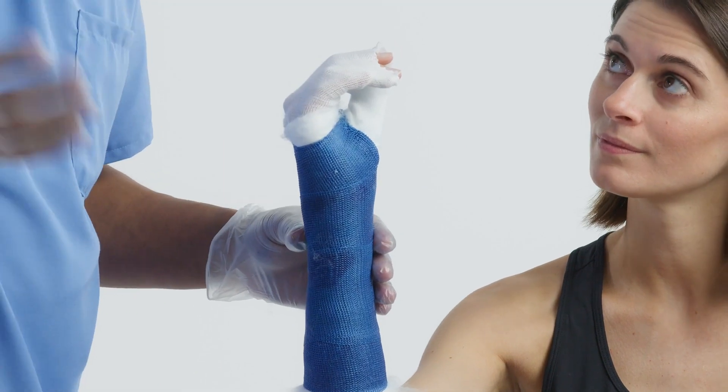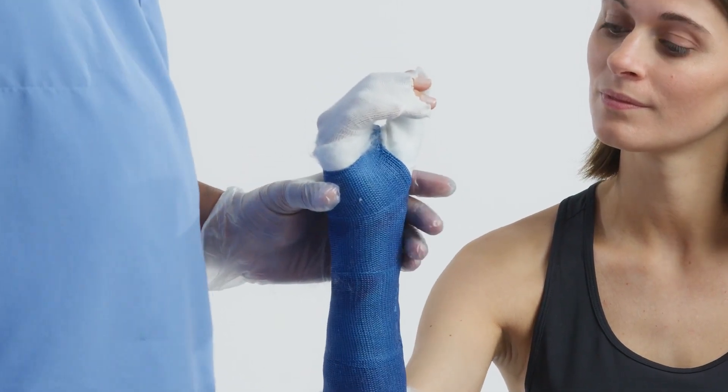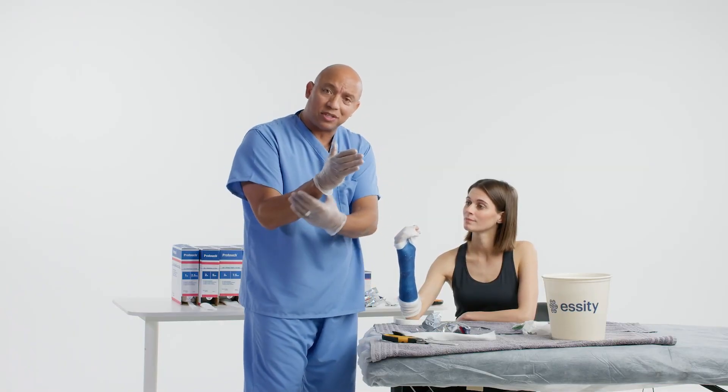Look from the side view — I'm trying to show a more flattened appearance on the dorsal and volar aspect. You can see that flattened mold there. That's what we want to limit supination and pronation. You don't want to put on a cast and it's just totally round looking and not fitting the shape of the patient's extremity.